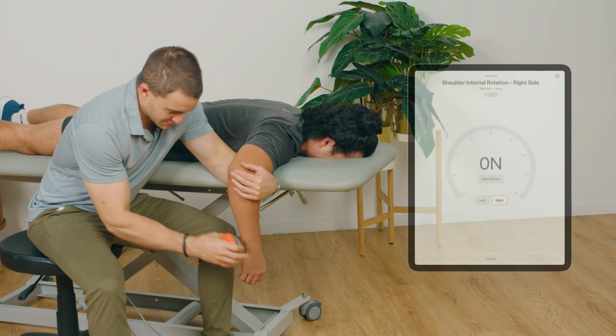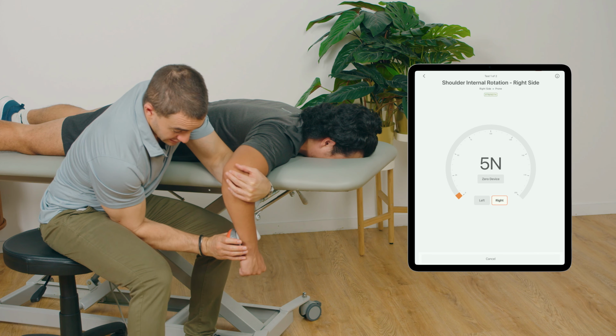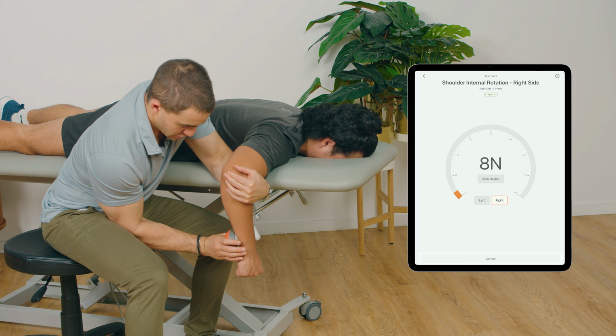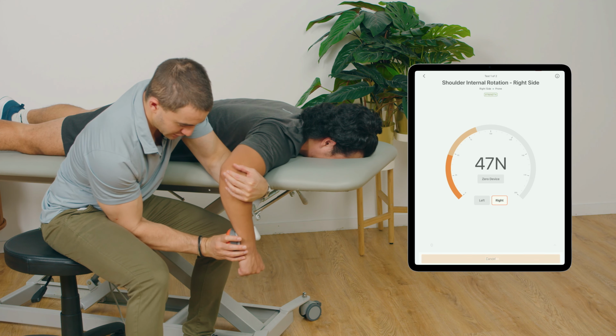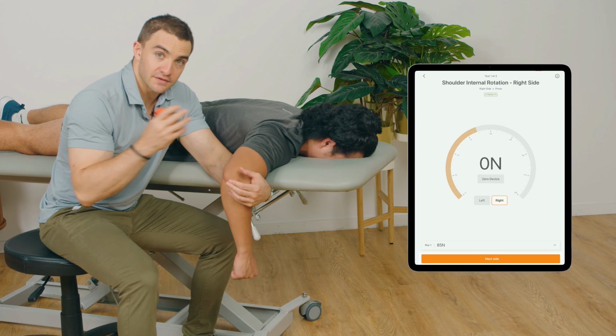So I'm blocking in this position, nice supported arm, handheld dynamometer in contact with the patient's body. And when I say go, it's going to be a make test. Cal's going to push as much force as he possibly can. 3, 2, 1, go, push, push, push, and relax. Good. I feel like I've got good control in this position. We've really isolated the internal rotators.